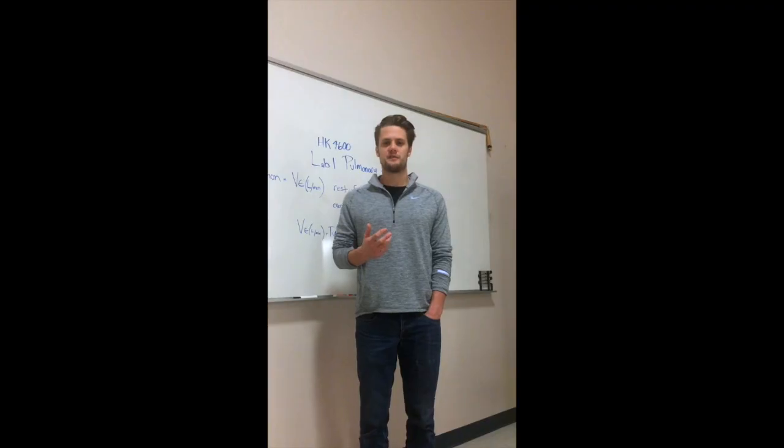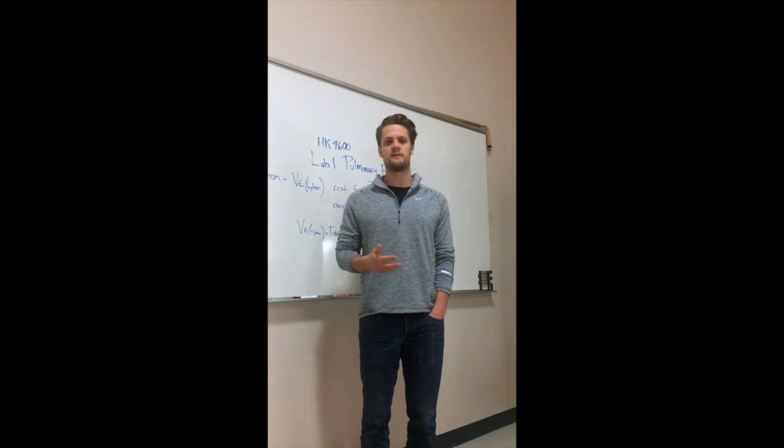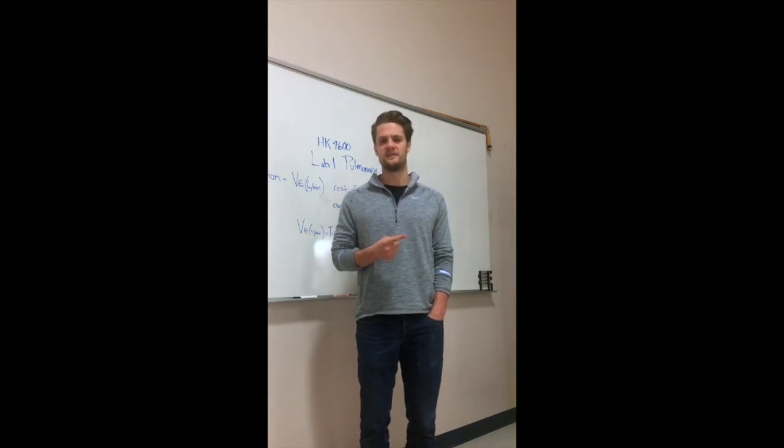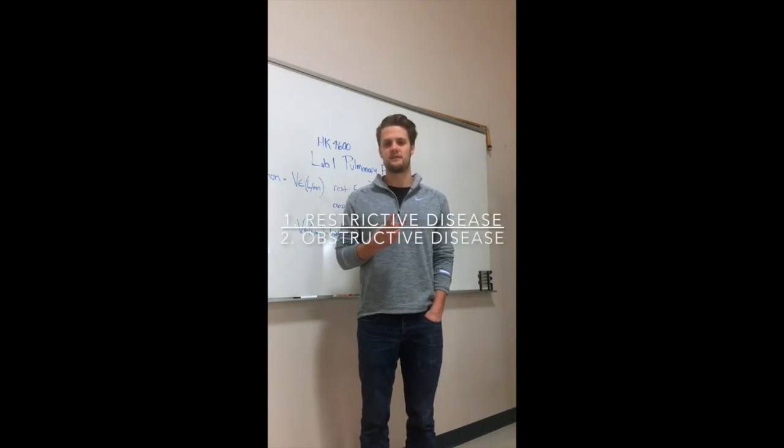Now, pulmonary function measurements, which we're going to do today, like I said, evaluate lung function. It's really to detect or monitor pulmonary disease or injury. There are two main types of pulmonary disease, and we're going to talk about restrictive lung disease and obstructive lung disease.